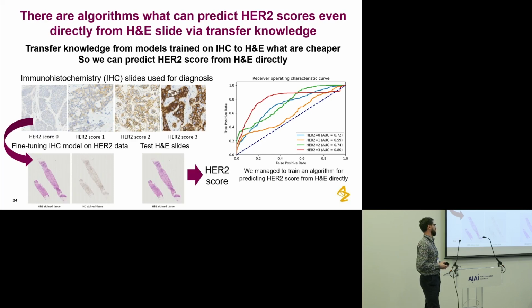I think it's still research, so I don't know if it will eventually end up in the clinic, but I think a lot of work in the H&E space is trying to squeeze out as much information from H&Es as possible, because it's still the gold standard. Any cancer patient, or any patient with some abnormality, will most likely have a biopsy taken, and then it will be analyzed by a pathologist. So the more we learn about H&E and the limits of H&E, I think the better. Potentially IHC won't replace it; maybe in 5-10 years genomics replaces everything, right? Maybe. So I don't know.